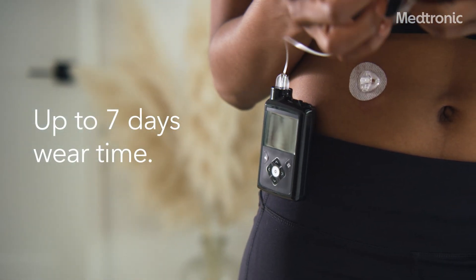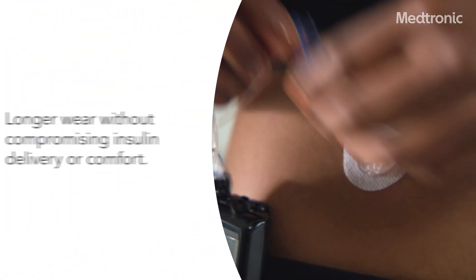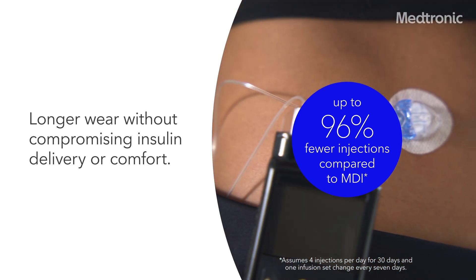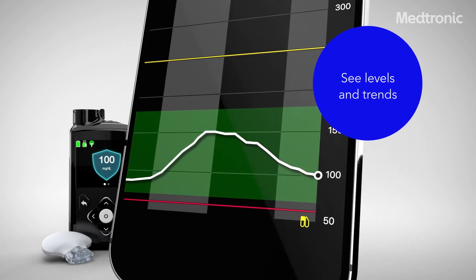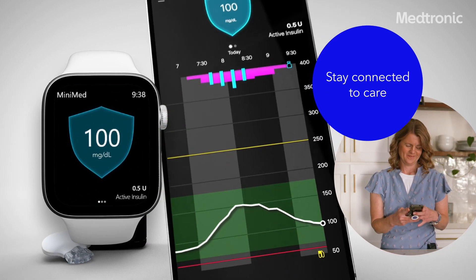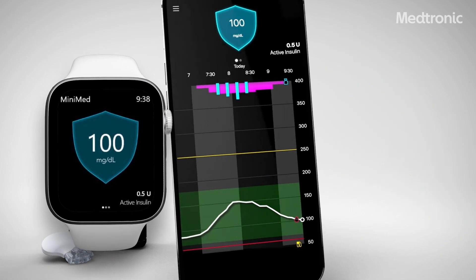Compared to multiple daily injections, using the MiniMed 780G system with Extended Infusion Set means 96% fewer injections. With the MiniMed mobile app, you can see your levels and get notified of highs and lows directly on your phone or Apple Watch. And with the CareLink Connect app, care partners can be notified of real-time sugar levels whenever you are.